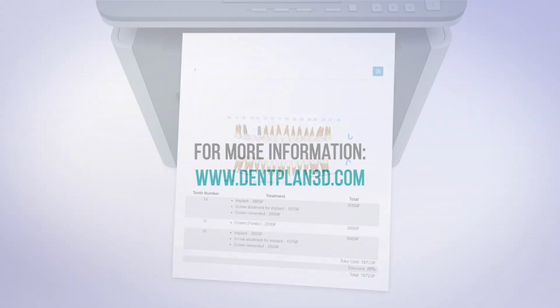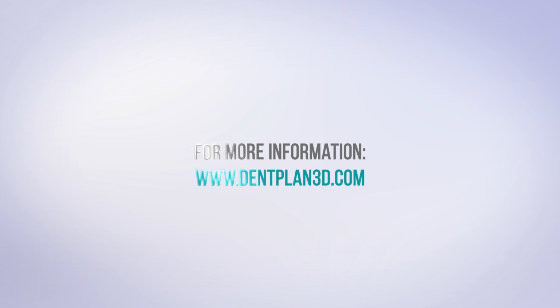Precision, personalization, and innovation at your fingertips. Start transforming your dental consultations today.